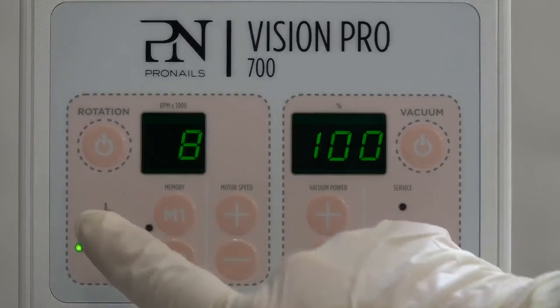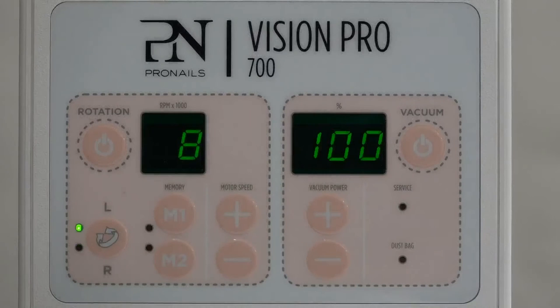8000 revolutions. Counterclockwise rotation L. Vacuum 100.